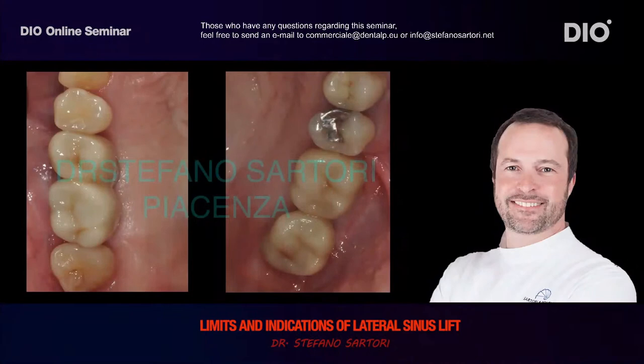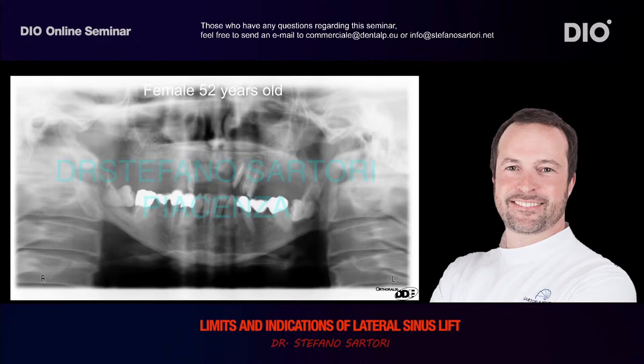In this case, I want to show you how to treat the failure of a sinus lift. Sometimes it can happen that you have a bacterial contamination of the sinus, and suppuration in a period that is usually immediately after surgery. I would say within the first 2 or 3 weeks.